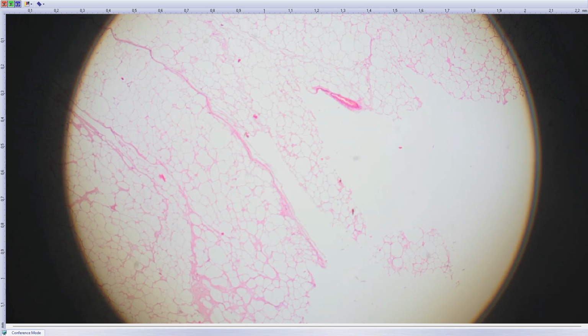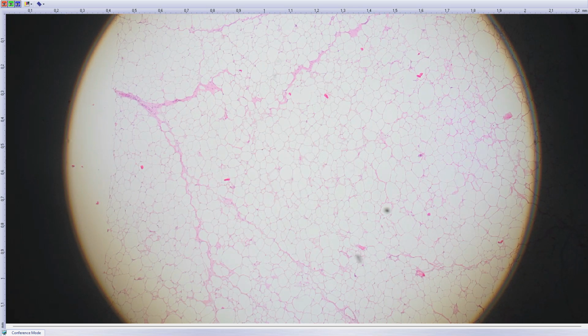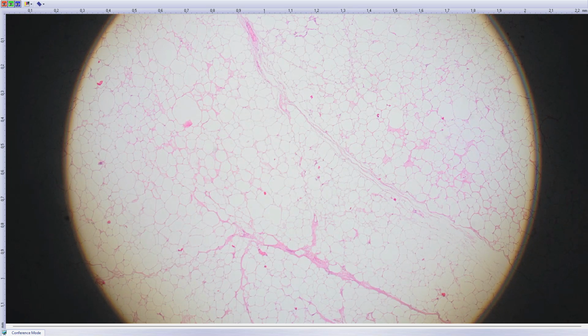It was a 60-year-old male, tumor in his inguina, and it was 18 centimeters in size. So what do we see here? The first assessment is easy. We see some very well differentiated lipomatous tumor. Obviously, the majority of lipomatous tumors in this location in peripheral soft tissues are just benign lipomas. I get all the lipomas from the faculty hospital, so it's generally like a 2-second diagnosis.